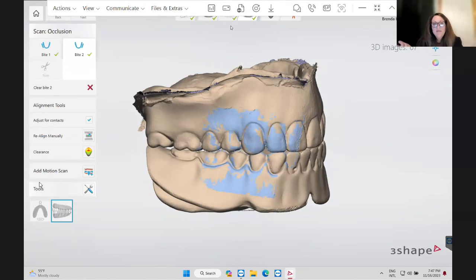It's a typodont, right? So when I'm with the actual patient, I like tongue depressors. I usually have the tongue where I push it down and out. I usually have the patient turn their head because saliva is a big issue, right? If it gets wet, we're not getting a good scan. And it's usually more of a four-handed dentistry technique. Absolutely four-handed dentistry.